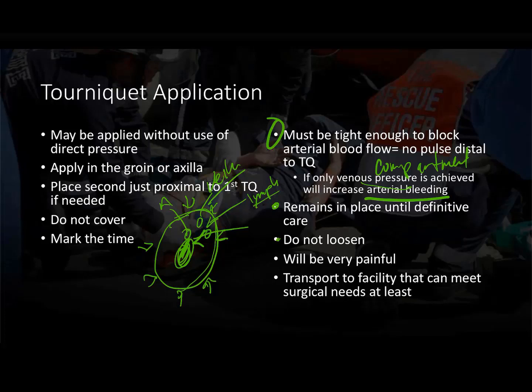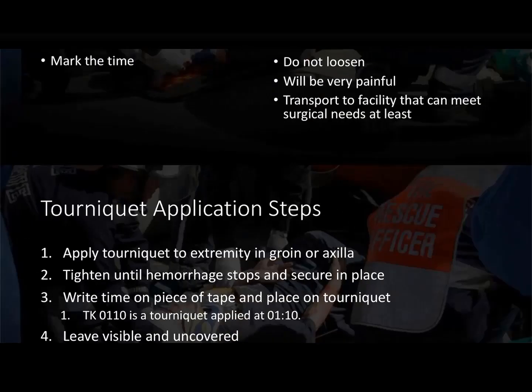Do not loosen once it's been tightened, and continually monitor to make sure that it doesn't have to be tightened over time. This is going to be very painful, so you should consider using pain management in patients that can achieve that based on their hemodynamic status.